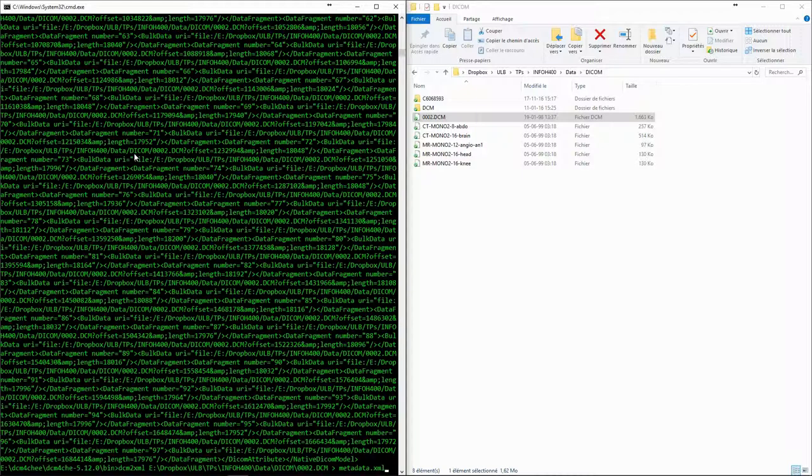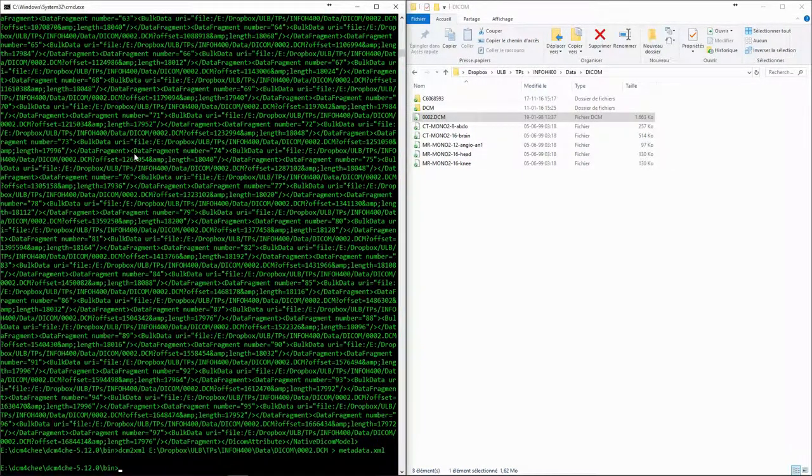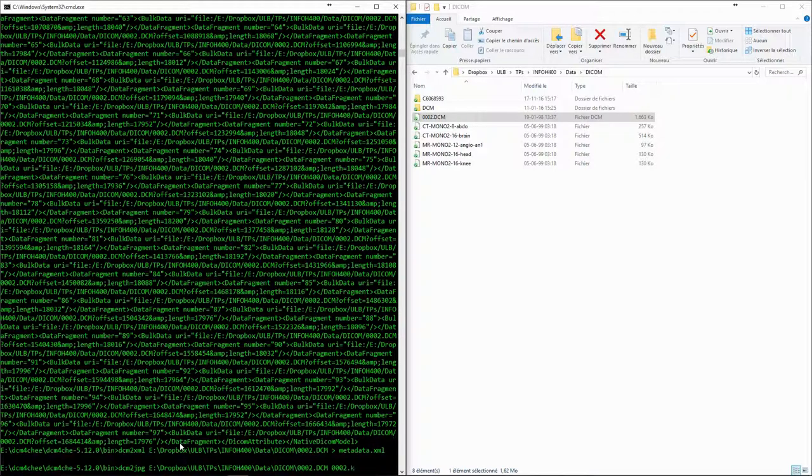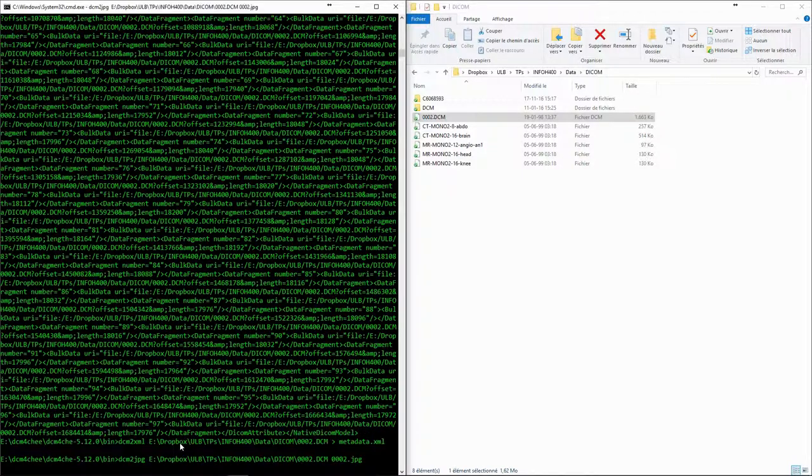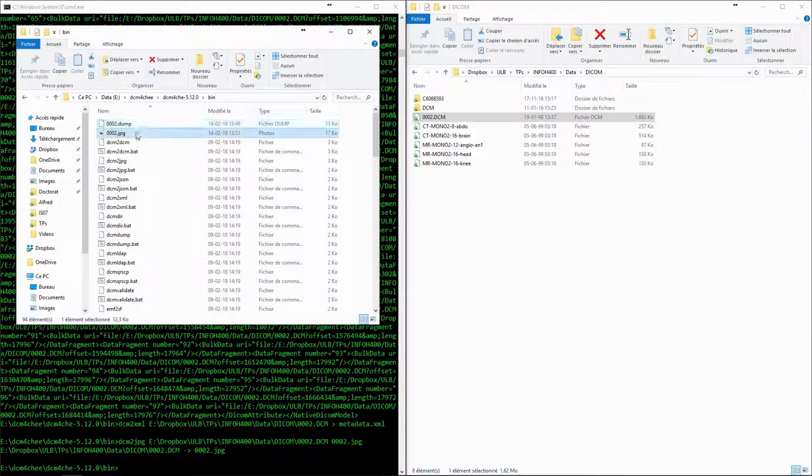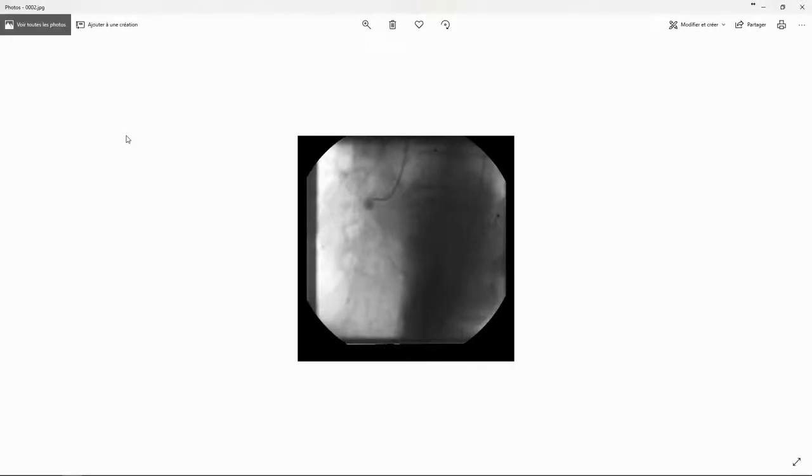In this case, we can also extract the pixel data of the image with DCM to JPEG. In this case, we export it to 0002.jpeg. We can then view this JPEG image in any image viewer.